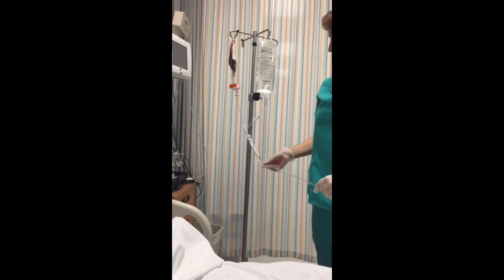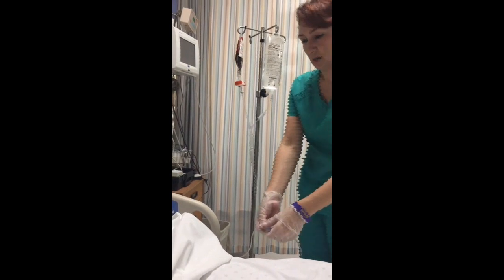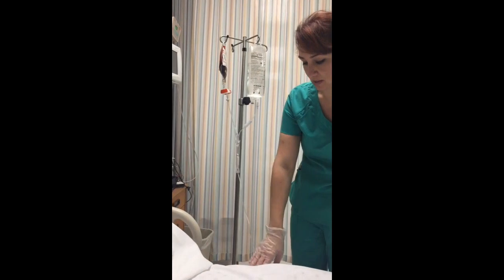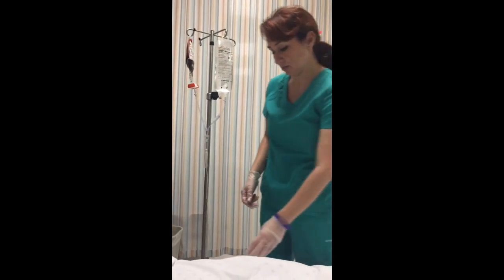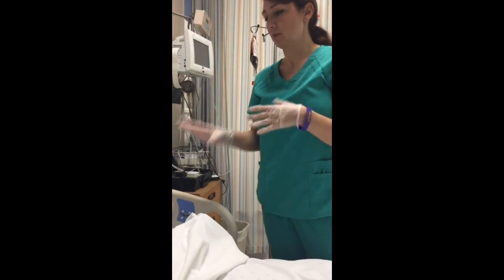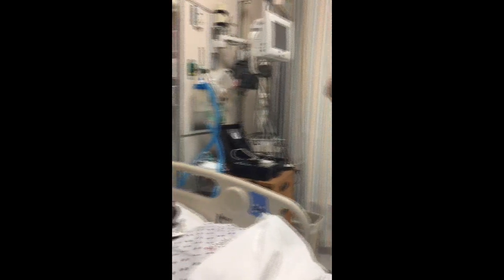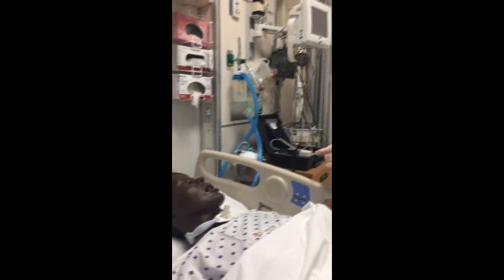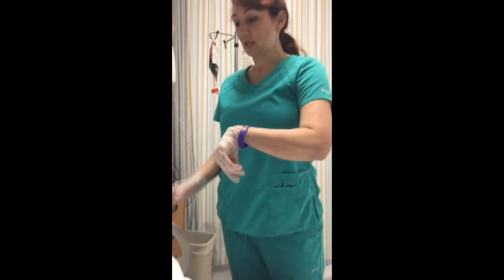We're going to start infusing slowly in case there's a reaction — just 25 to 50 milliliters for the first 15 minutes. We're going to stay with the patient and check vitals, asking: are you having any flushing, trouble breathing, rashes, itching, or hives? We'll look at the patient and make sure we don't notice any flushing in the face, trouble breathing, or scratching. She looks like she's tolerating it fine. We'll stay at her bedside for those 15 minutes.